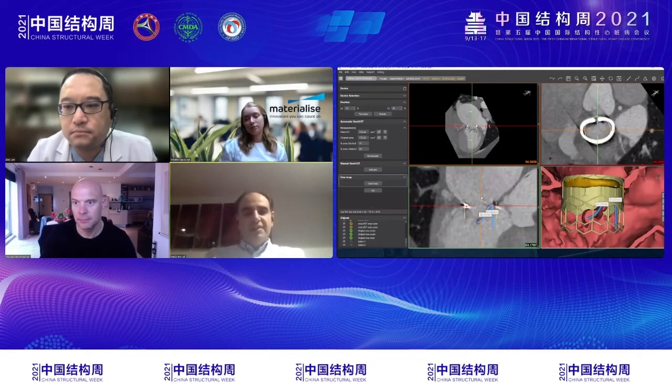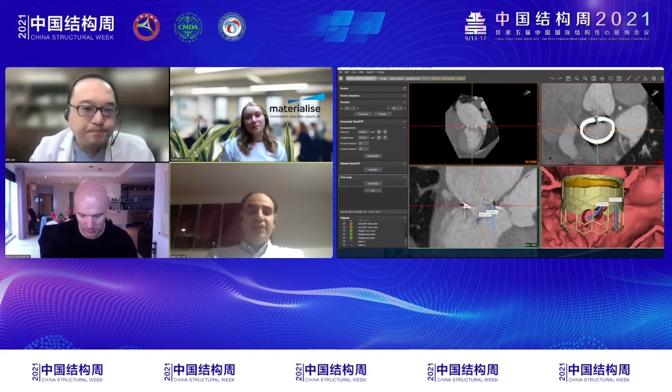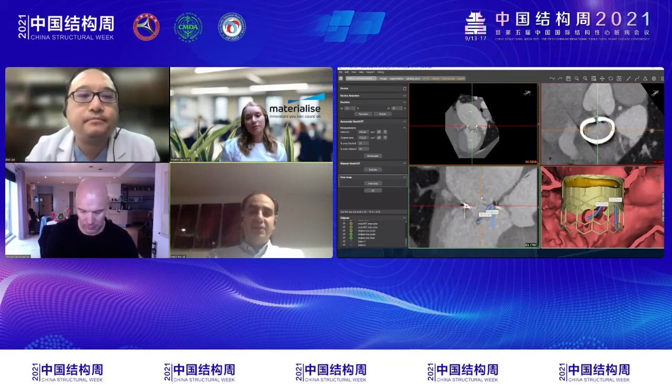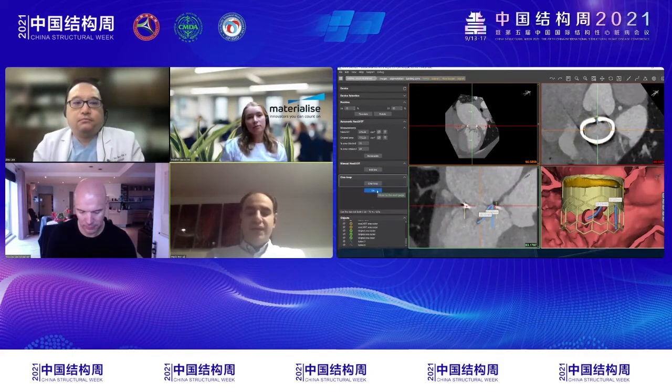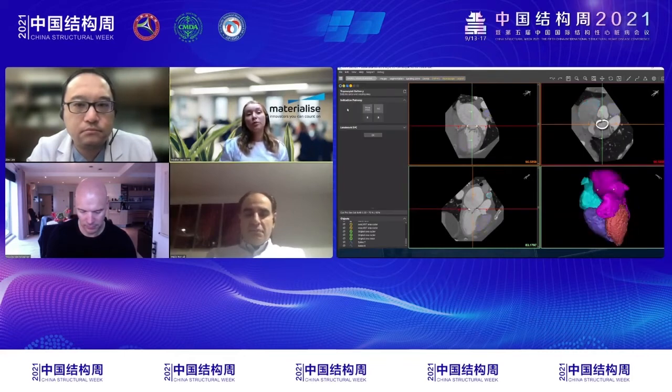So this is your mission in the next years, to have this for us as an implanter, because that will help a lot, because we will characterize the tissue, mitral valve tissue, aortic valve tissue, and this will give us a very additive value and help us to plan our cases, I think. Yeah, I completely agree on that.